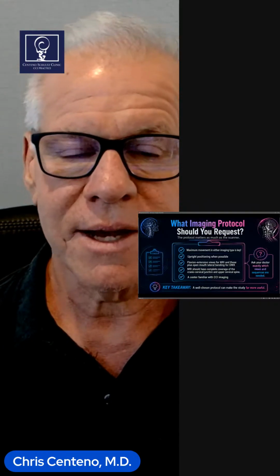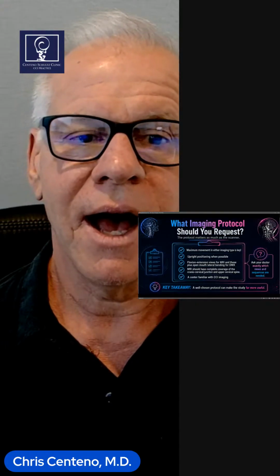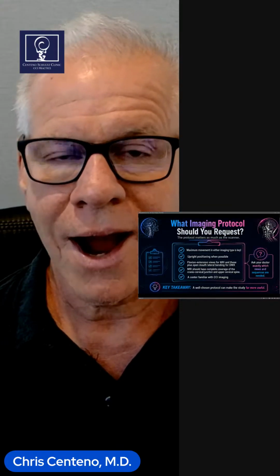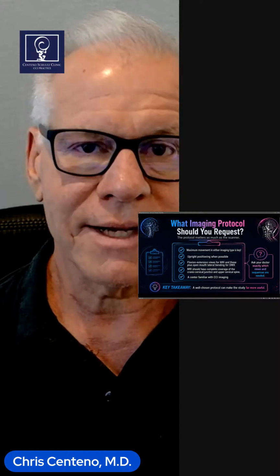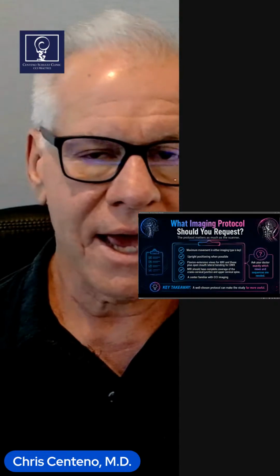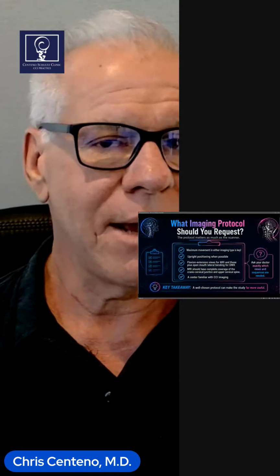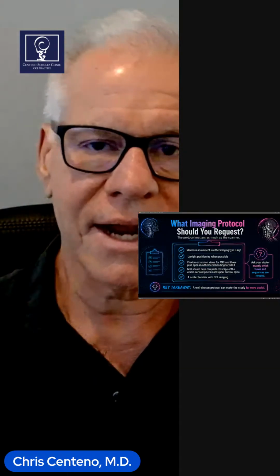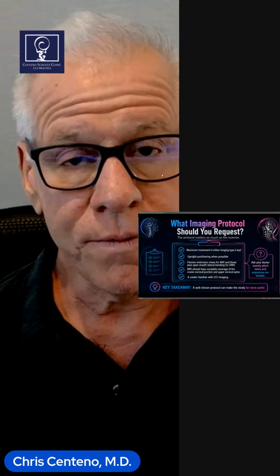So if you bring me something like a static CBCT from your local upper cervical chiropractor, that doesn't help me diagnose CCI. Or if I've got a static lie-face-up-in-a-tube MRI, again, not that helpful because there's no movement component. The same would hold true for just static x-rays. So the first rule is movement.